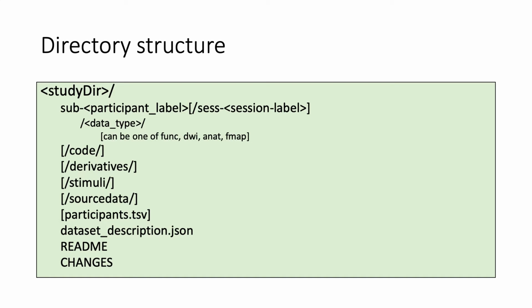Are the DICOMs mandatory? Because I've heard some people say that they only want to share skull-stripped data because when you include the DICOM, you have the image of the face. So for sharing, you don't have to share the DICOM if you don't want to. This is just a suggestion for how in your own lab you might organize the data. For example, I have an R01 that is required to submit data to the archives at NIH. Not so cool, it's a pain in the butt. But I only share the minimally processed data. I don't give them my DICOM.